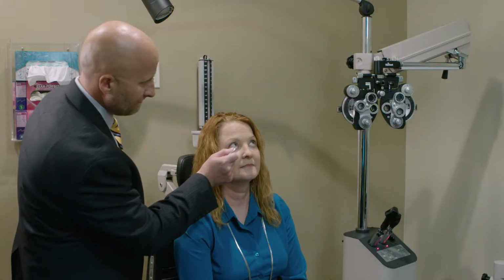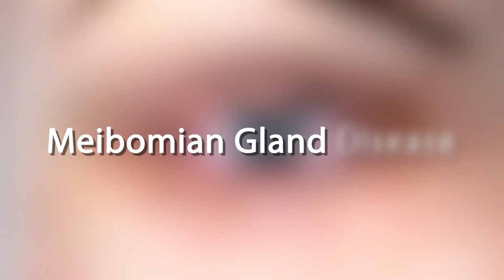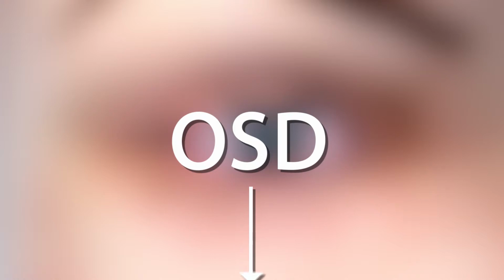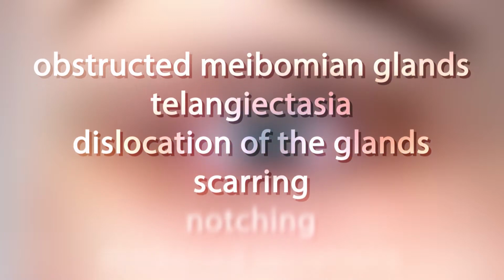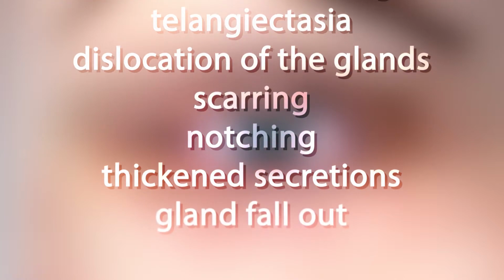Following an evaluation of the tear film breakup time with fluorescein and lid wiper epitheliopathy with lissamine green, we move on to a thorough evaluation of the eyelids and meibomian glands. Meibomian gland disease, MGD, or posterior blepharitis is now often thought to be one of the primary causes of ocular surface disease. It is a chronic progressive disorder. It results in obstructed meibomian glands, telangiectasia, dislocation of the glands, scarring, notching, thickened secretions, and gland fallout.